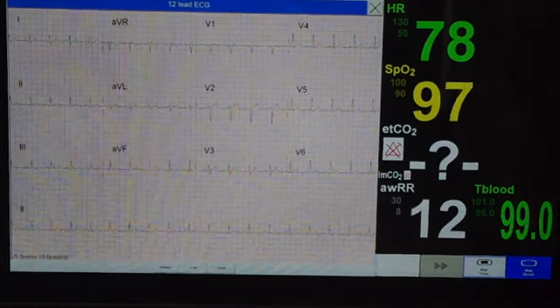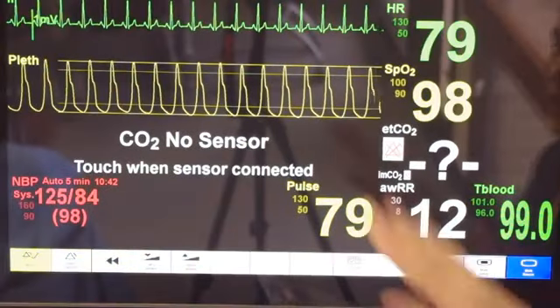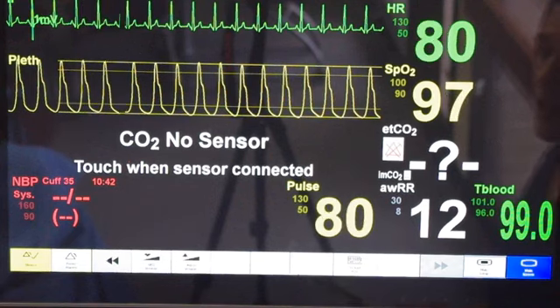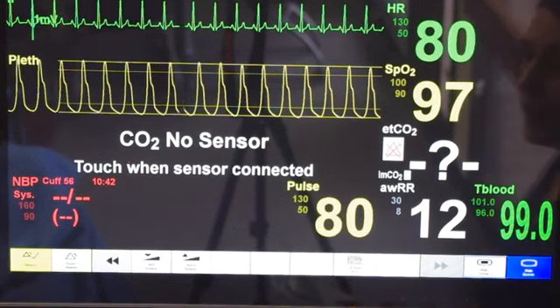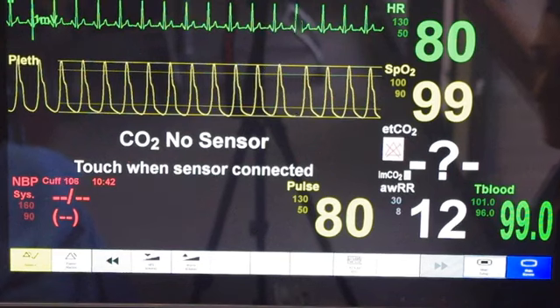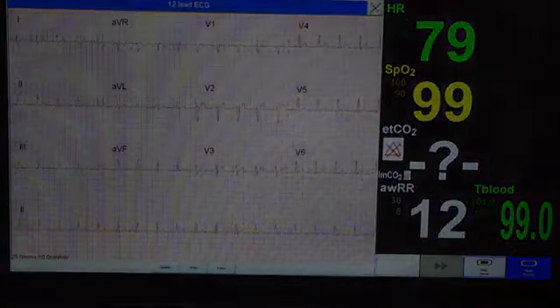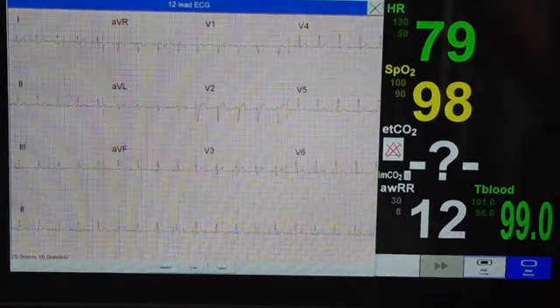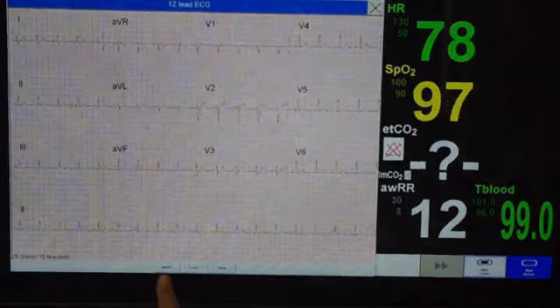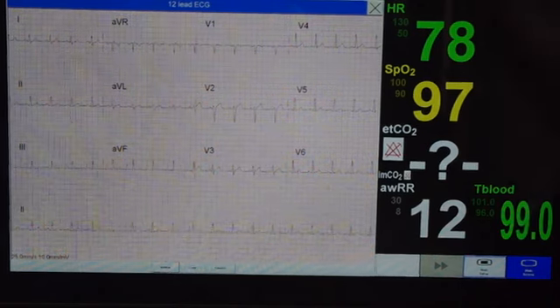So if you close it out, then you go back to your normal screen. And you can always, if you have a change in your patient that you think it would be appropriate for you to do another one, you can hit the button again. So now say you do that and something is immediately changing, your patient's condition is changing. You can also hit update, and that will give you a new view of what's going on with your patient.